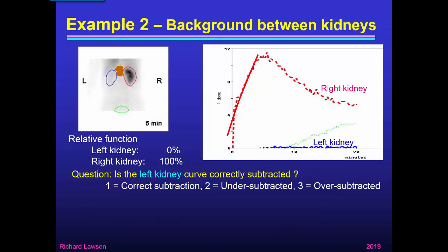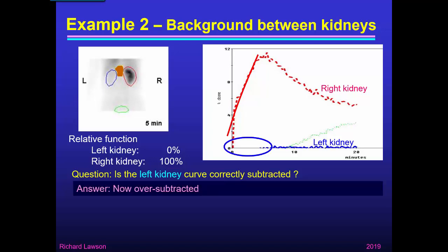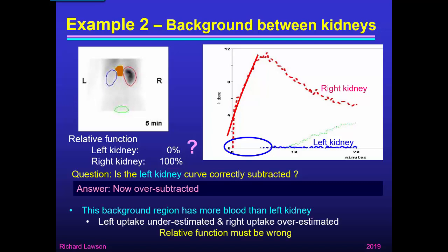What about the left kidney? My answer is that it is now oversubtracted — we've taken off too much background. The curve has gone negative, although the computer has decided not to display the negative part of the curve, but you can see it obviously started off below the axis. This particular background region has more blood than the left kidney but less blood than the right kidney — so the left uptake was underestimated and the right uptake was overestimated, meaning the relative function must be wrong. 0% for the left kidney can't be right.